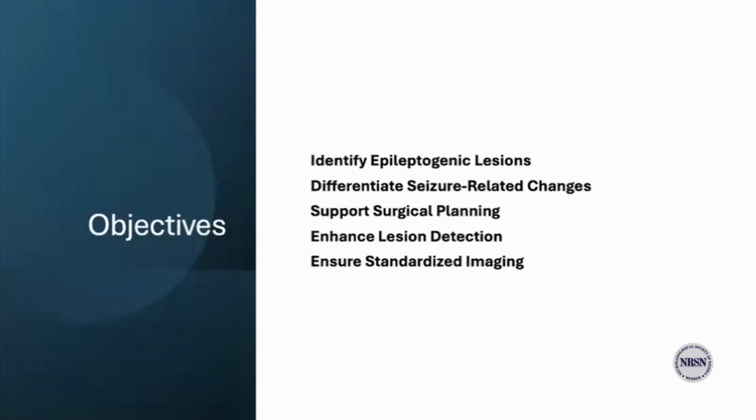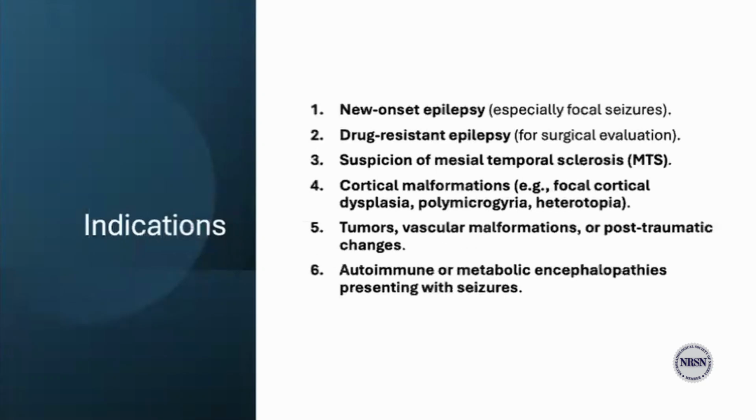And finally, it ensures a standardized approach to imaging, so no critical information is overlooked and comparisons can be reliably made over time or even between institutions. So when do we actually use the epilepsy MRI protocol? There are several key clinical scenarios where this targeted imaging is valuable.